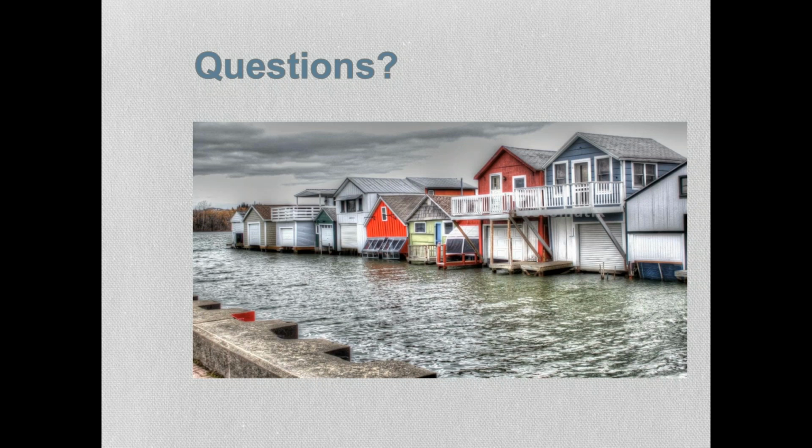Another question about the methodology. Have you tried primary formalin fixation on fluid sediment, recentrifugation, discarding the formalin, and then fixing in alcohol formalin? We have not. You have not, okay. I think this was, again, primarily for IHC purposes. It was one of our participants asking that question.